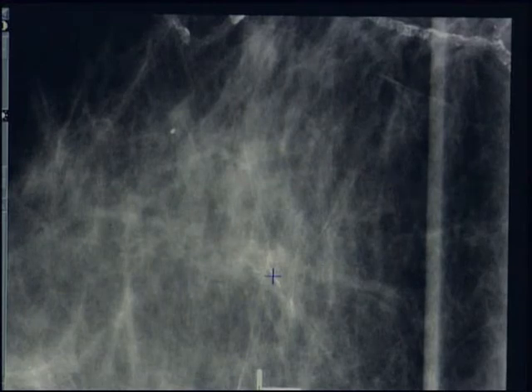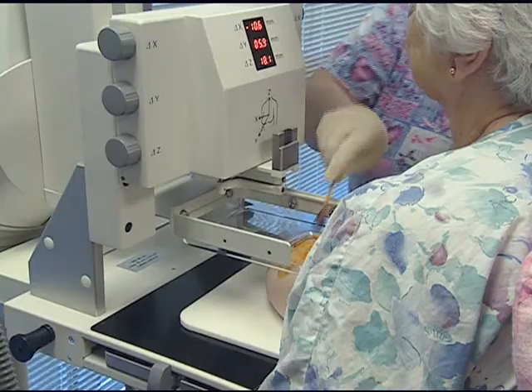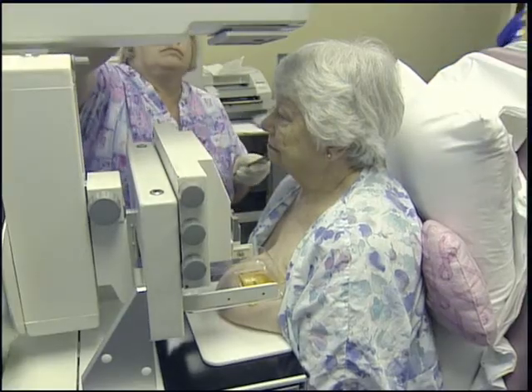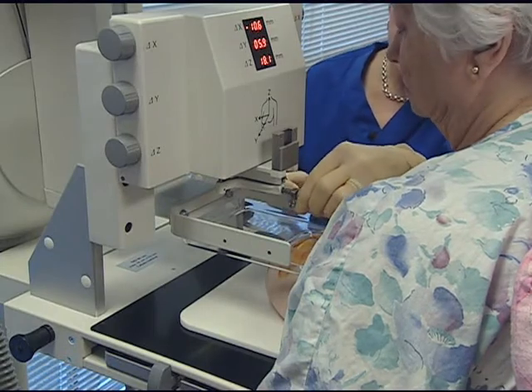The Vacora 10-gauge biopsy device actually pulls in tissue around the mark, so we're going to get quite a bit of calcification in this sample. The patient is prepped by applying antiseptic and the appropriate biopsy accessories are attached to the stereotactic imaging device.